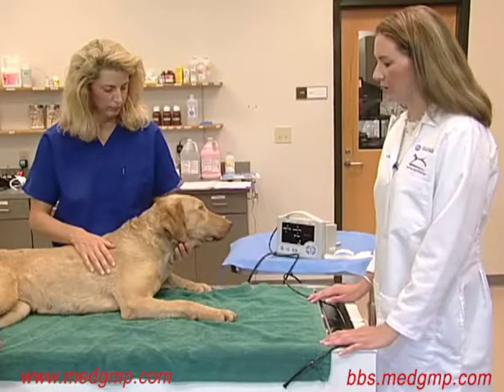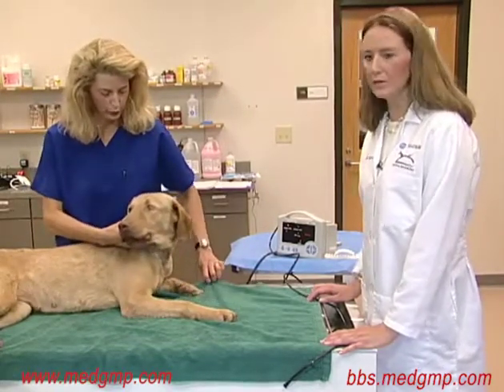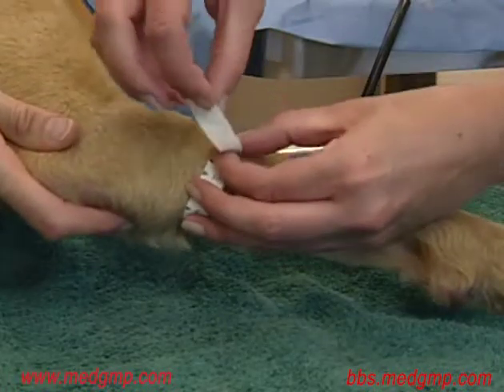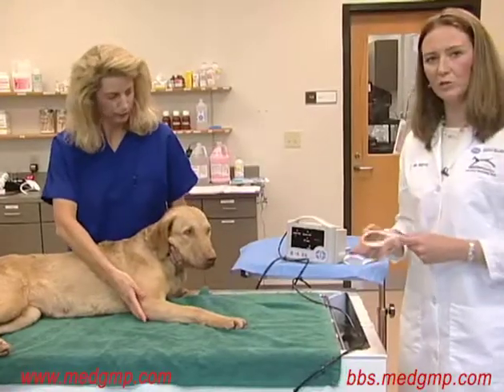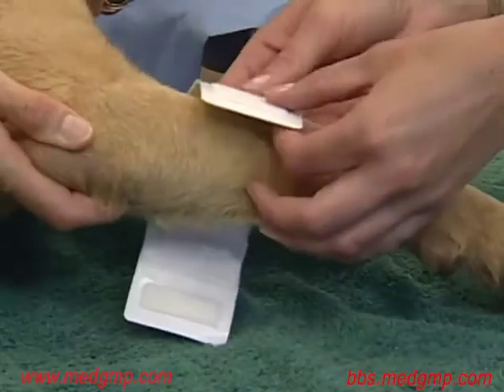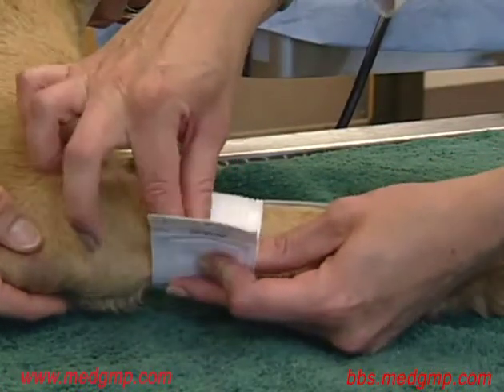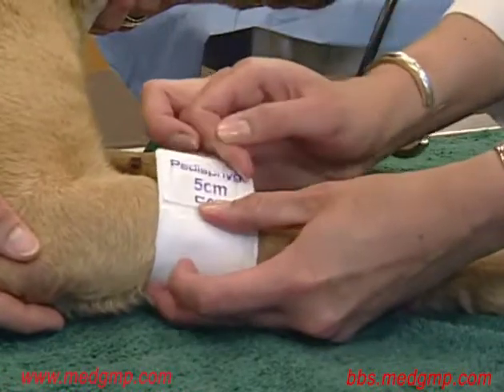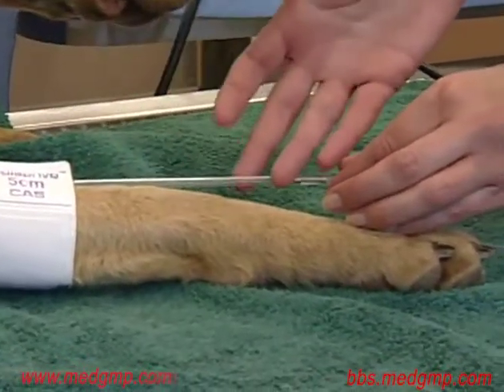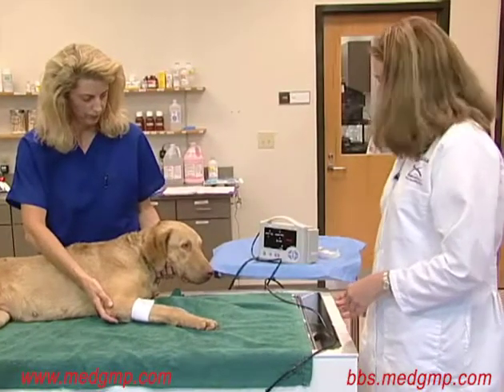In this case, we have our patient sternal and we're going to place the cuff just below the elbow. As before, it's important to measure to determine the correct cuff size — measuring the circumference of the limb in centimeters and multiplying by 0.4. Once we've determined our cuff size, it's very important to make sure the hair coat is flat; wetting the hair down with alcohol or water can be helpful. It's also important to make sure the cuff is flat with no rolls, and the tubing extends down the limb in conjunction with the direction of the artery. We then secure the cuff with a small piece of tape.